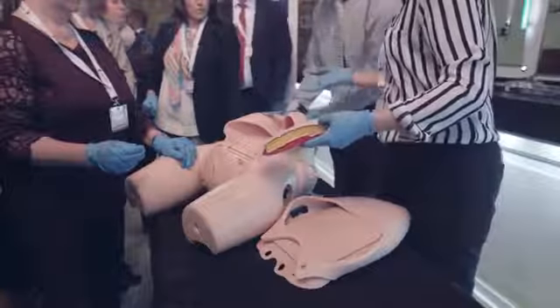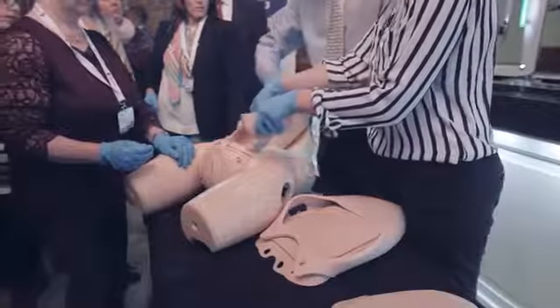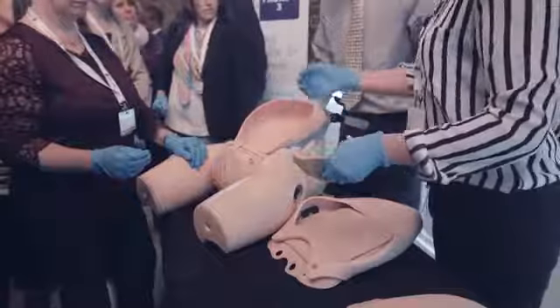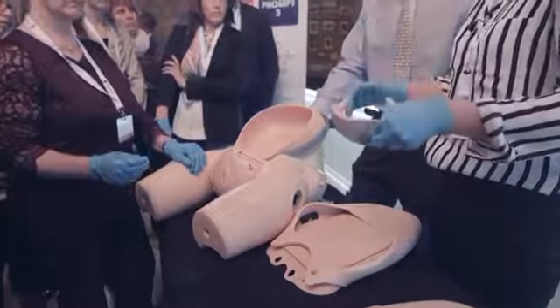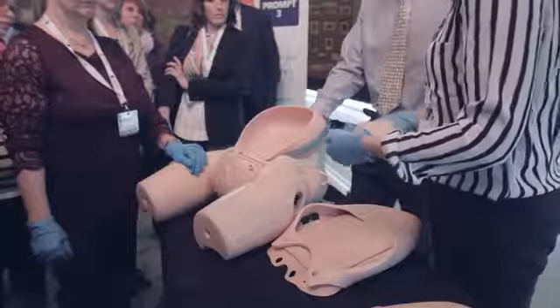And then Nick, you were saying earlier about how there's this extra insert that we can put inside that simulates, say, a 4 centimetre caesarean section where the head is a little bit higher, so that trainees can just focus on the basics of practicing, okay, standard caesarean section, just delivering the head. And then obviously you can practice suturing as well.